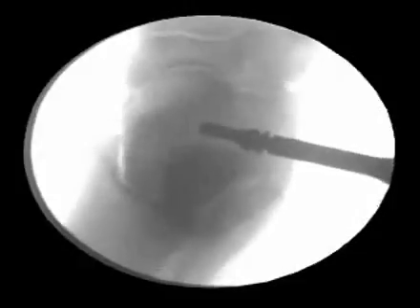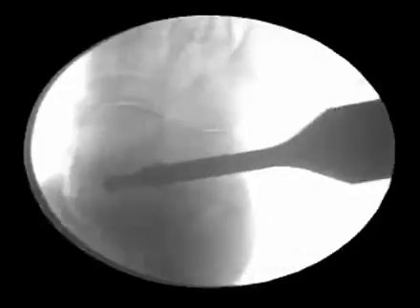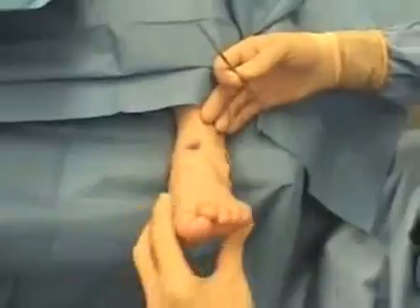So again, here is the stent going in. This is lateral to medial, so this is an incorrect angle. What we want to do is just angle that more posterior, aim it into the head to the posterior aspect of the medial malleolus, and you push the stent in until it won't go in anymore, and you're done. You should always check these under fluoroscopy as well to make sure that you've seated it correctly. So again, incorrect to correct. We just really want to bury that stent in.